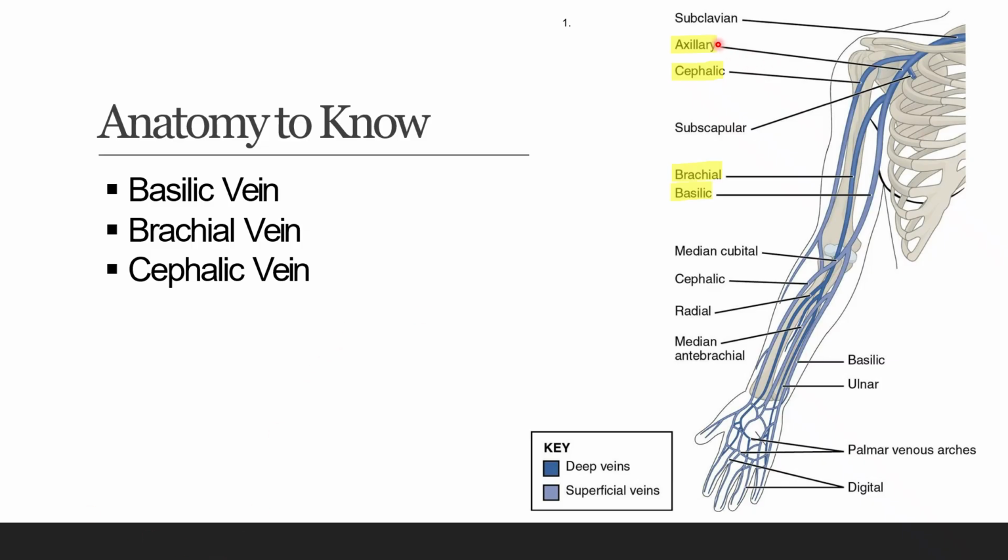First one's the axillary vein. You can see it over here near the axilla. The main reason I labeled this is you want your midline catheter to eventually have its distal tip somewhere within the axillary vein. Once it progresses past that and into the subclavian, you start to get more into the territory of a PICC, although a PICC has to land over the actual cavoatrial junction.